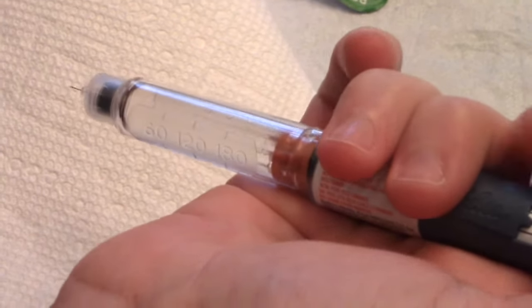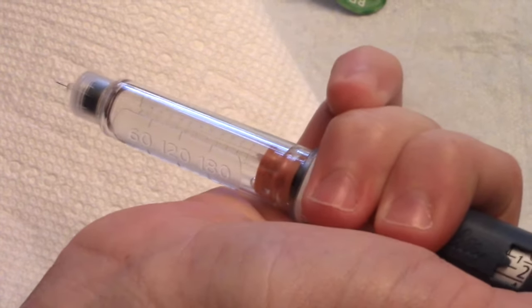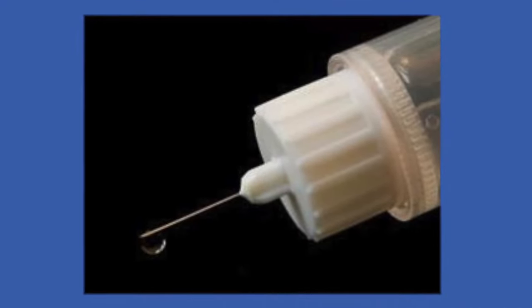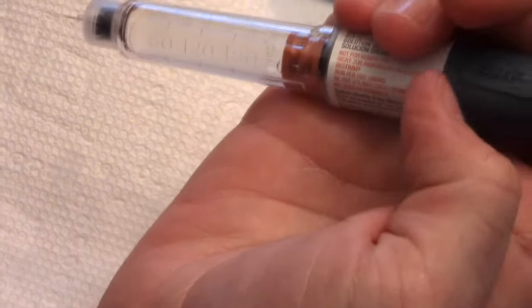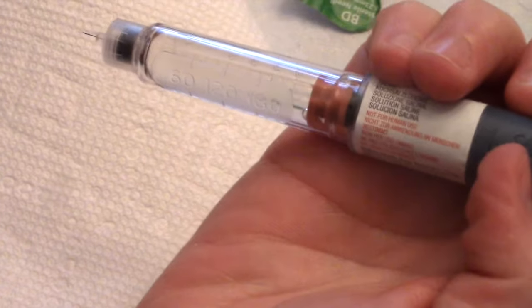When you push down on the top, you'll want to see fluid coming through the tip of the needle. That way we know it's primed. Do this step anytime before you administer insulin using an insulin pen.